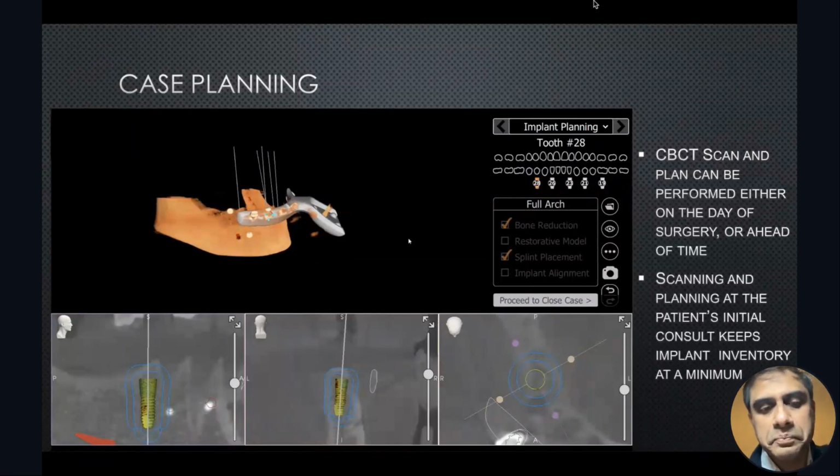in that site automatically. All you have to do, if you notice certain blue lines on the periphery of the implant, that is giving you the 3 millimeter mark. So it's no brainer there. You want to make sure that you're 2 or 3 millimeters away from the nerve, or 3 millimeters or plus away from the next door neighbor implant. So there's really no major calibration. You don't have to get a scale or a ruler to measure anything because it's right in front of you. So that really helps you place the implant, and you can review that on the axial, the sagittal, and the anterior posterior, the mesial distal, positioning of the implant.